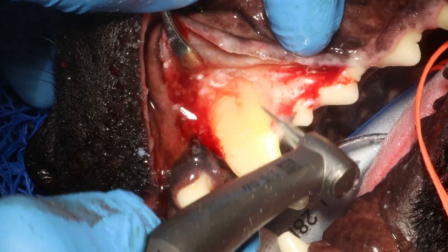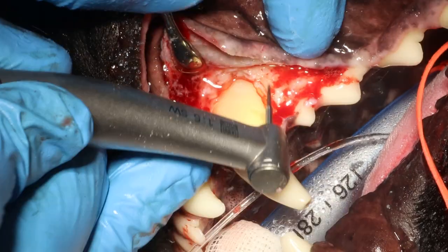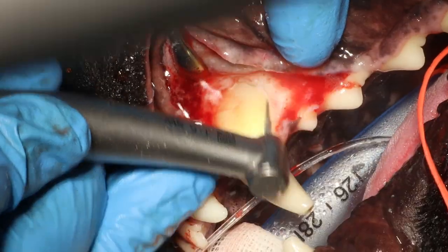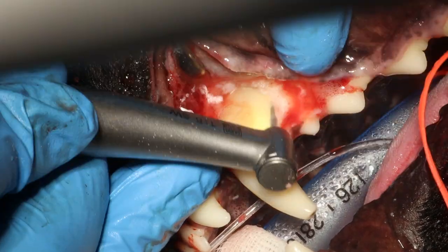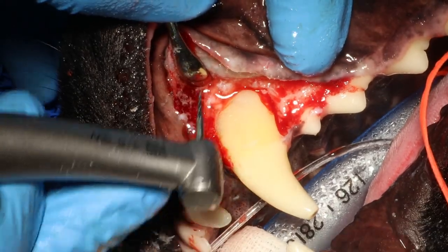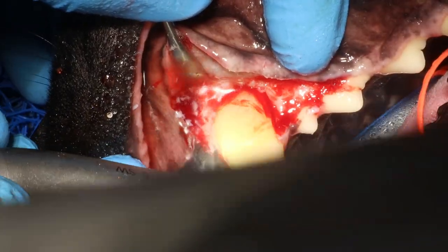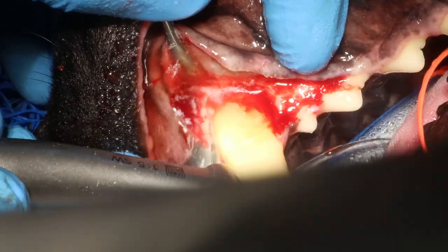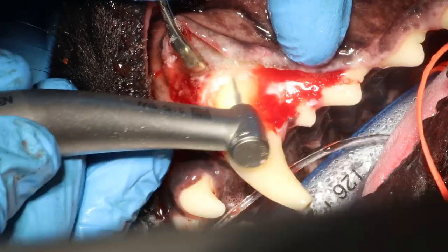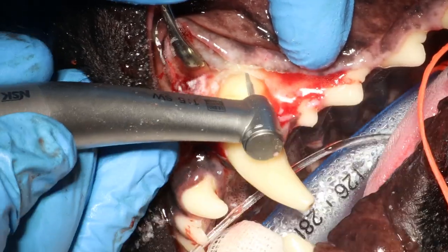Now I'm creating my grooves distal and mesial to the root. The reason I do this is to outline the root with a groove where I can place my luxator. On the mesial aspect you can go pretty deep — there are no structures you can damage. In a large breed dog like this you can go at least half a centimeter into the bone on the mesial aspect.